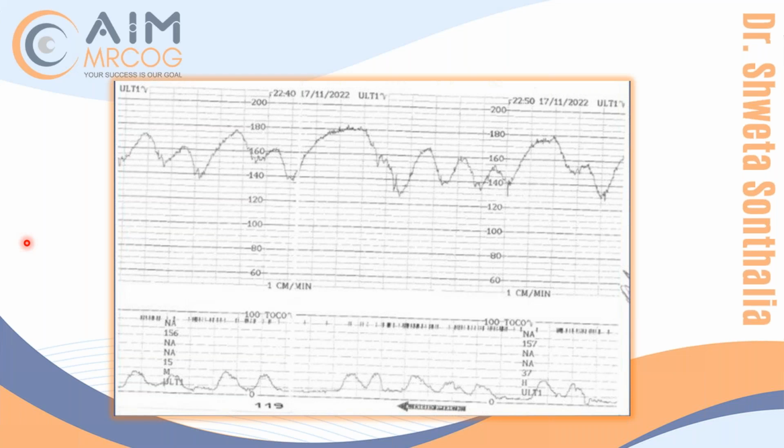There is very little time for the baby to recover, so the recovery time is really reduced. There are a lot of decelerations. They are variable, and the variability is also lost at the time of decelerations, so that's also not a very good sign. This looks like a subacute type of hypoxia.